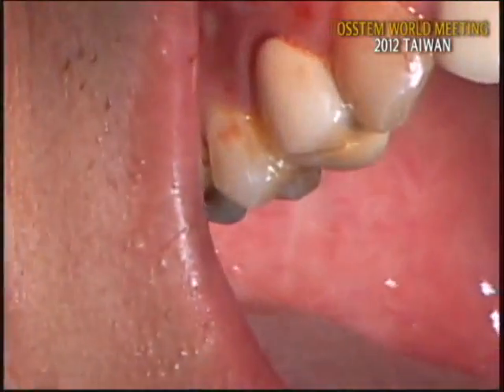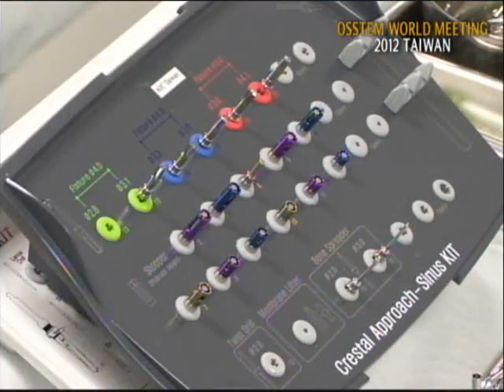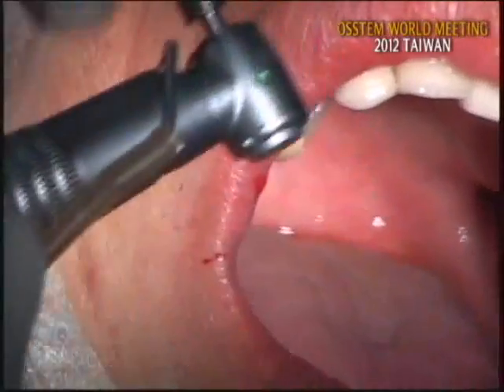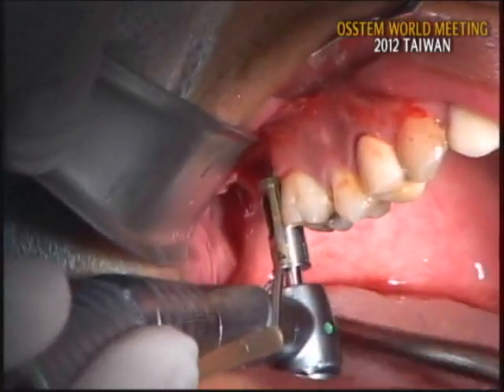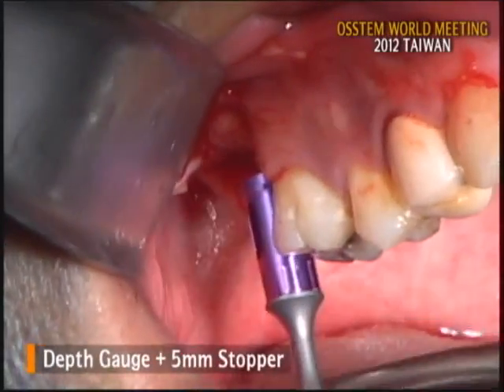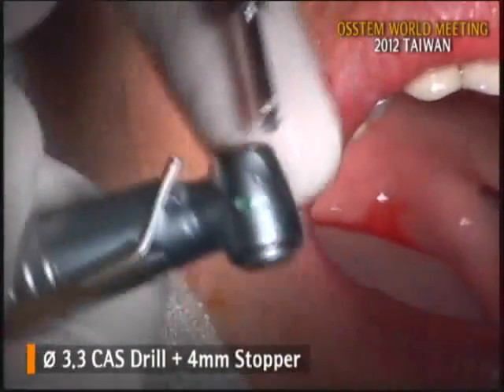Then keep the stopper and change the drill to the 2.8 CAS drill. I think the bone of the patient is softer, so I'll follow the soft bone protocol. So the next drill is the 2.8 CAS drill with a 4 millimeter stopper. Let's check if the sinus floor is penetrated or not. Not yet. Next, the final drill is the 3.3 CAS drill with the same 4 millimeter stopper.